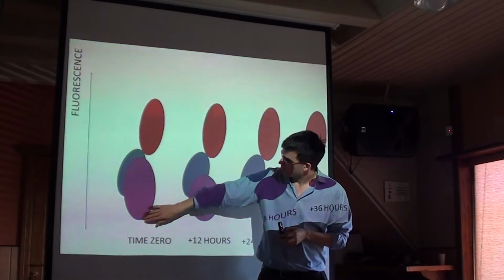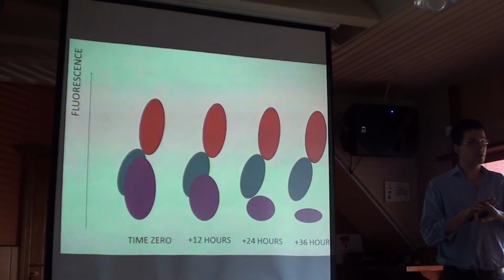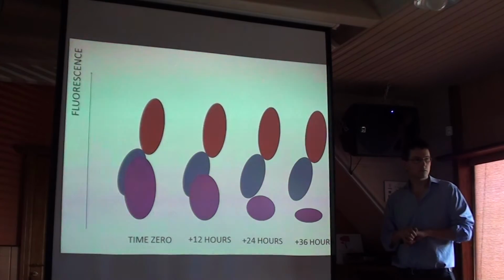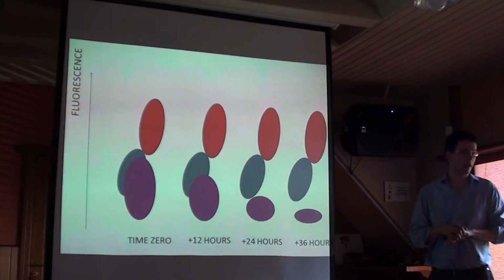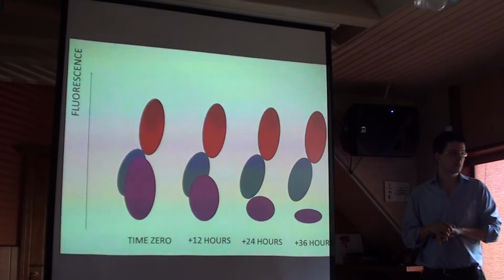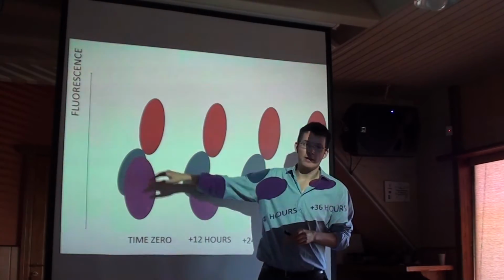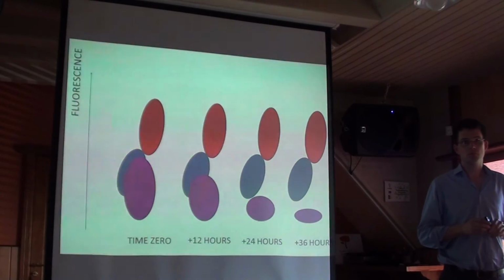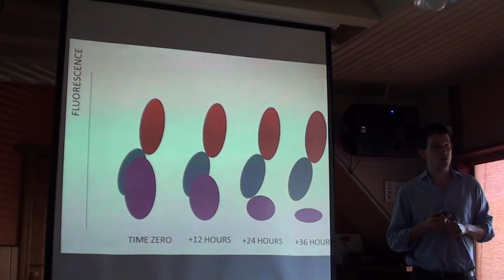So in this first sample, remember, if we have overlapping clouds, the analyzer has not been able to distinguish one population from another. Will the numbers that come out of the analyzer be correct? No, the numbers are going to be wrong. Do we need numbers? We probably don't need numbers because we can see we've got a lot of immature neutrophils.